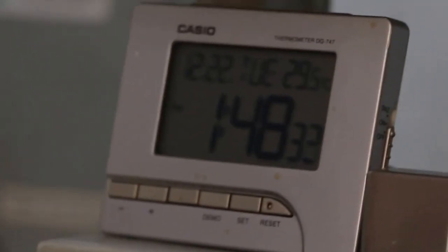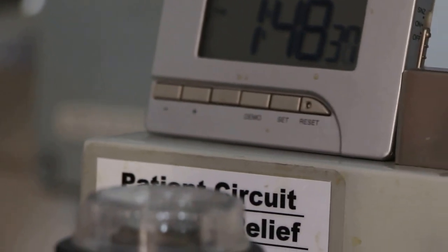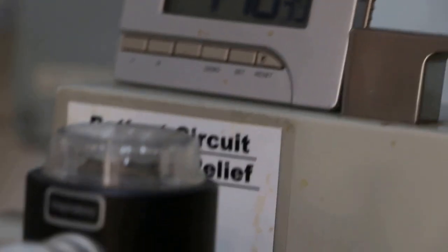Okay, don't take too long — I think we have less than 52 minutes. Okay, irrigate and then let it go. Put it inside the container first here. That's it, finished.